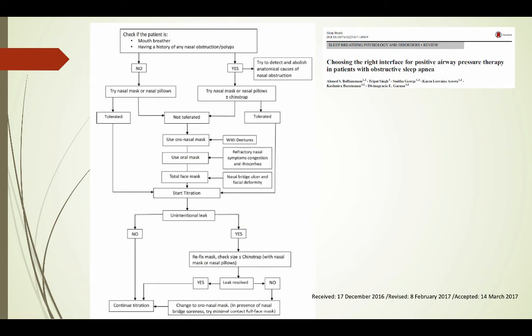So all this summary that I have shared with you, I have put it in an algorithm which we published in 2017: always start with a nasal mask and try to use a nasal mask with chin strap before shifting to an oronasal mask, and that should be your last resort. If you need, I'll be happy to share this article with you.